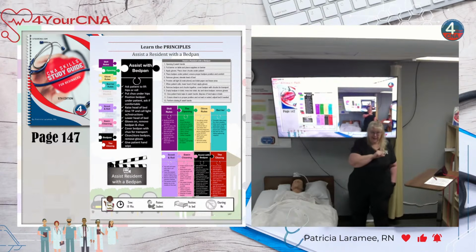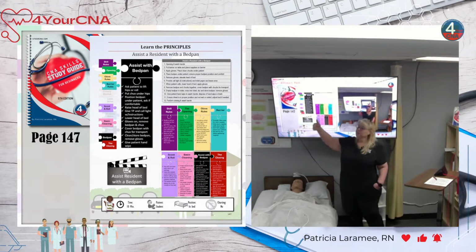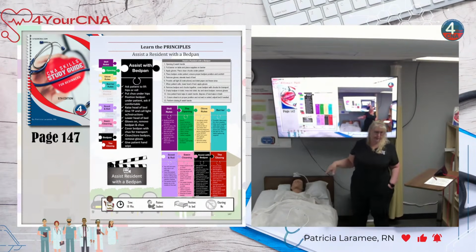You're not going in the bedpan, but somebody will put a bedpan under you and they will take the bedpan out. They're not going to try to clean you, and I'm going to explain why in just a second. It's simply you're going to sit on the bedpan and they're going to take it away. You're not actively going to use it. So when you are the patient for this, you're going to get instructions. Put this gown on, get in bed, don't pee. Okay. When you're the CNA or the candidate testing for this, you're going to be told to follow the care plan. Good. And I'm going to explain why in just a second.